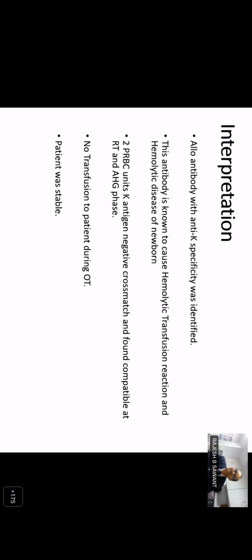And Dr. Jayasri asks, what is the current policy of antibody screening in antenatal patients? Antibody screening, in fact, for all patients in good institutions, and accreditation requirements also specify that all patients who are likely to require any transfusion should be screened at least once for the presence of these irregular antibodies. What is variable is the technology used, because there are still some centers that just use pooled O cells for antibody screening, because of cost, logistics, etc. Whereas what is recommended is that for patients you use a proper 3-cell antibody screening panel.